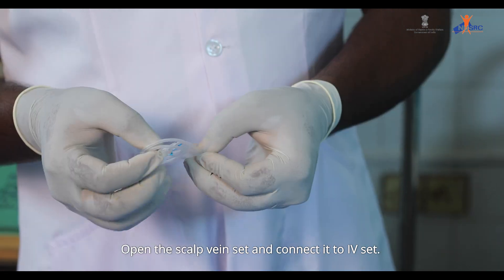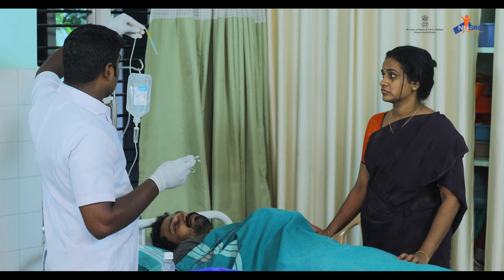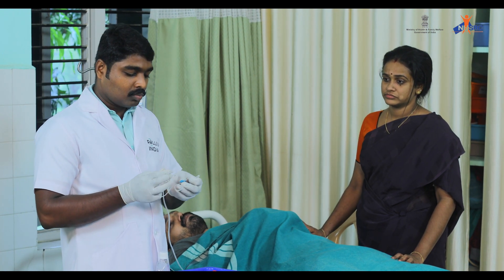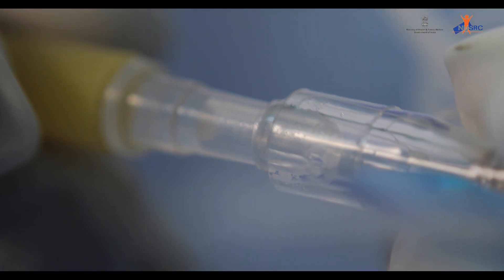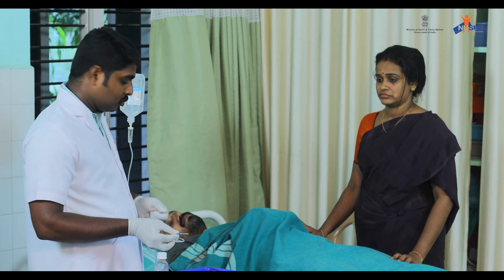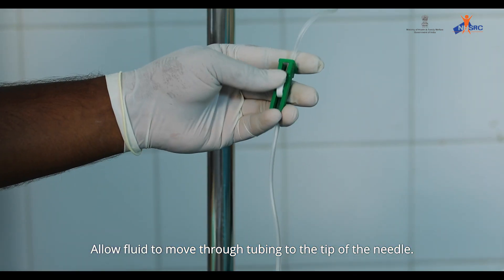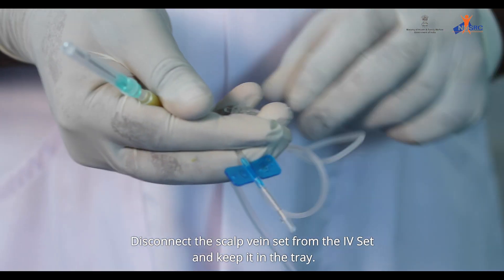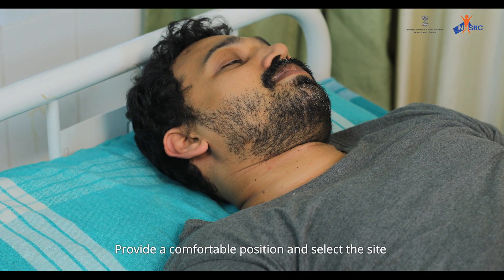Open the scalp vein set and connect it to the IV set. Allow fluid to move through the tubing to the tip of the needle. Disconnect the scalp vein set from the IV set and keep it in the tray.